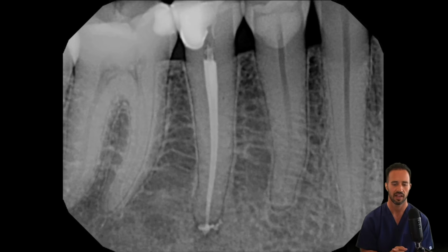And we can see there, after we've taken off our rubber dam, we've taken our post-op radiograph, and our obturation looks good. The gutta percha is well adapted to the walls. It's at a length that I feel comfortable with, and you can see the temporary restoration there.